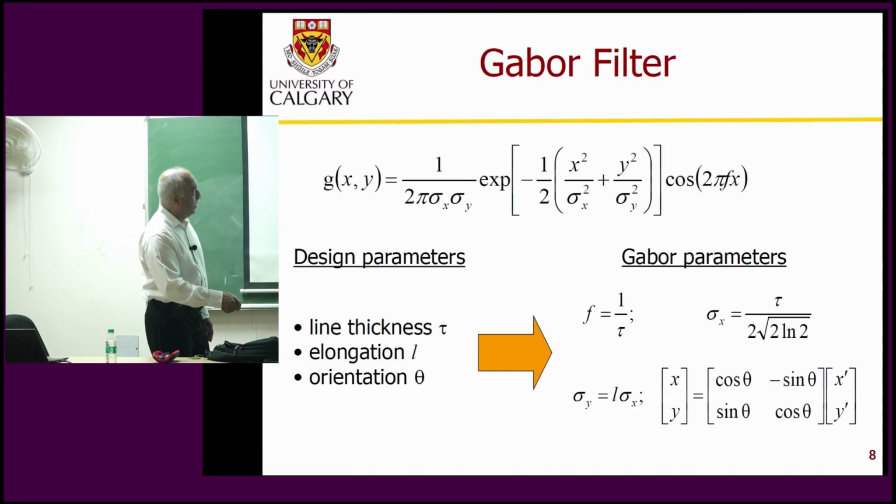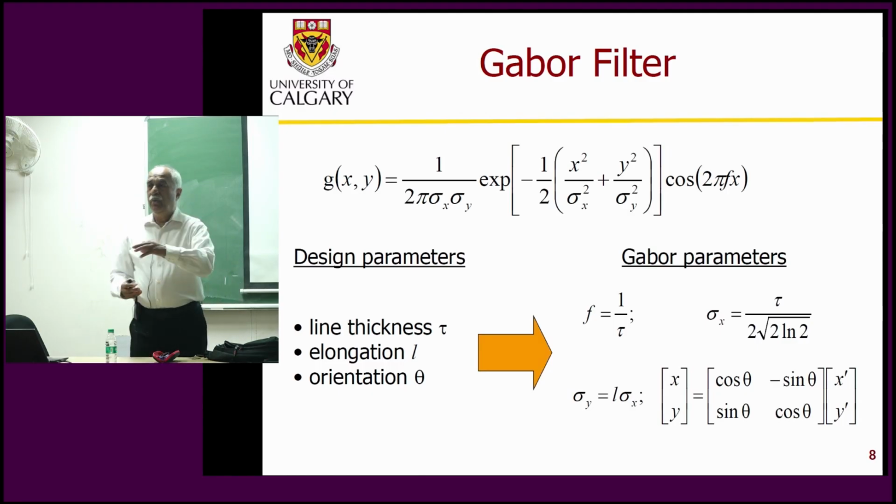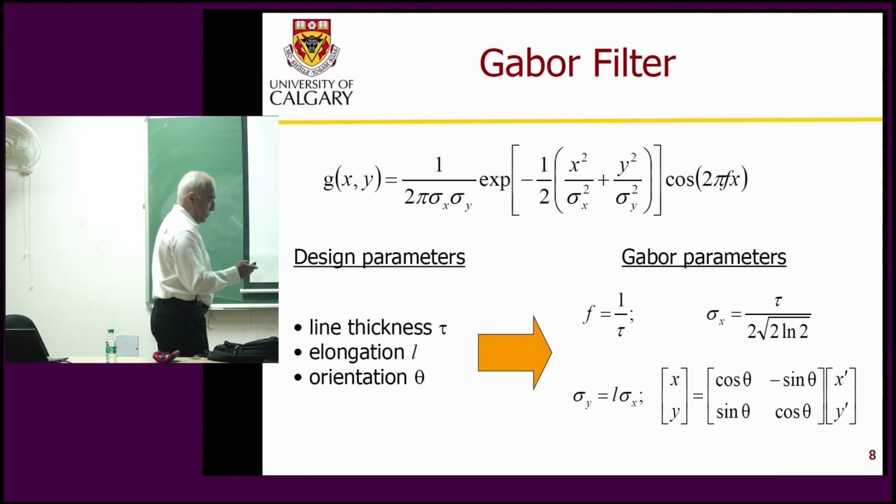And then you rotate with angle theta, whichever angle you want and how many other angles you want. We went 1 degree at a time, minus 90 to plus 90, or 0 to 180, but we mapped it minus 90 to plus 90, about the horizontal.